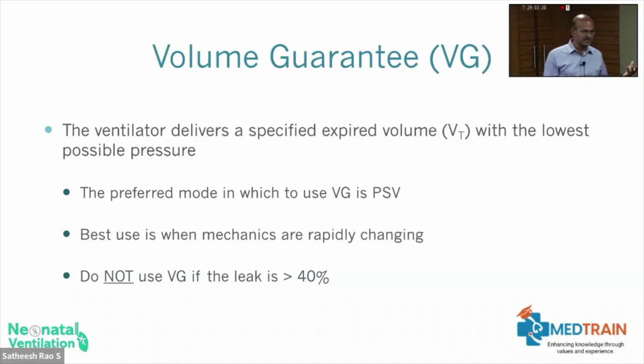The leak means that you're not going to deliver the volume with the pressure you set that you expect to reach. Suppose you were reaching 22 with the leak, you may need 20 if you correct the leak. So that's what you see like the RAM cannula, we talk about the non-invasive ventilation. There is a leak around it and there is a circuit compensation as well. So you're increasing the set pressure to compensate.